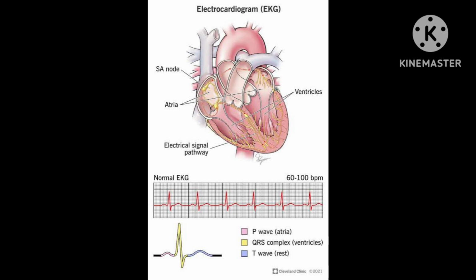Actually, this ECG has some special applications also. It can also reveal irregularities in heart rhythms, meaning heartbeats, known as arrhythmia. Irregular heartbeat is known as arrhythmia.